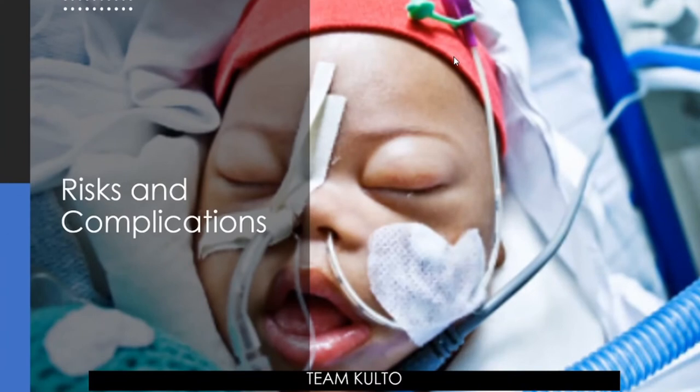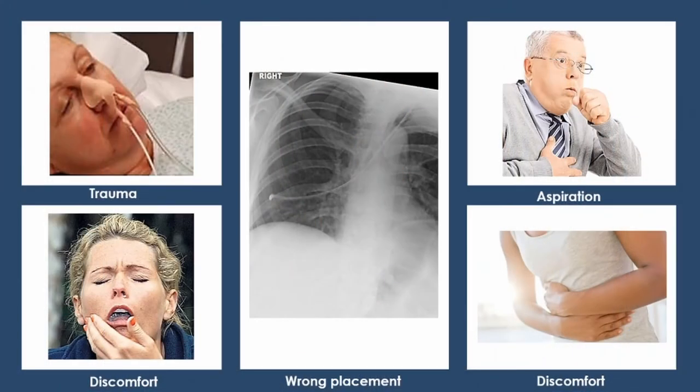Now, as with most procedures, NG tube insertion is not all beneficial to the patient, as certain risks and complications are involved. What are these risks and complications that I'm talking about? Okay, here are some. The main complication of NG tube insertion include aspiration.